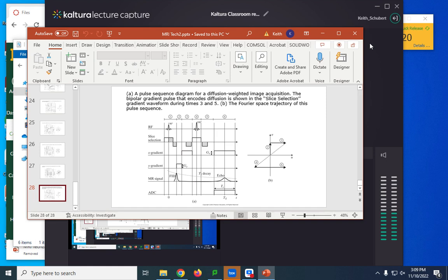I have one general question. A lot of the timing constraints of MRI are, to my knowledge, based on the Larmor frequency. So if the Larmor frequency goes up, everything's faster. And the Larmor frequency increases directly with B0. And B0 is your main magnetic field.